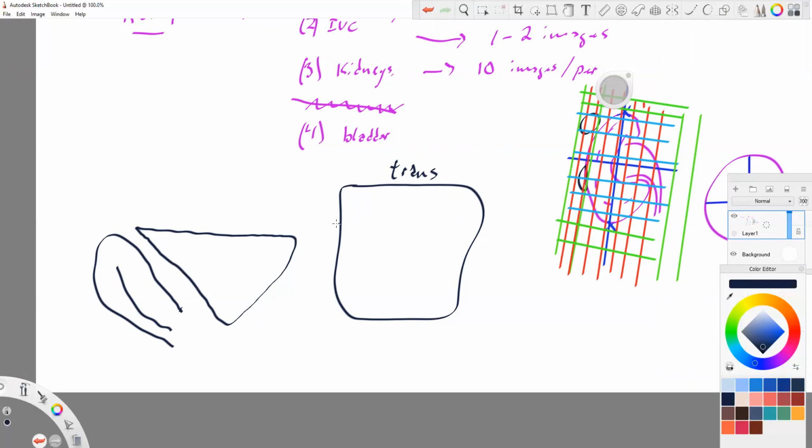Well, the first thing we're going to do, let's get the measurement out of the way. So we'll make measurements a pretty color of blue here. We're going to go to the caliper on our machine and choose a, I forgot what it's called, but basically it's a volume, a three orthogonal volume. So we could do, and I don't care, honestly, with this one, length, width, height, whatever.